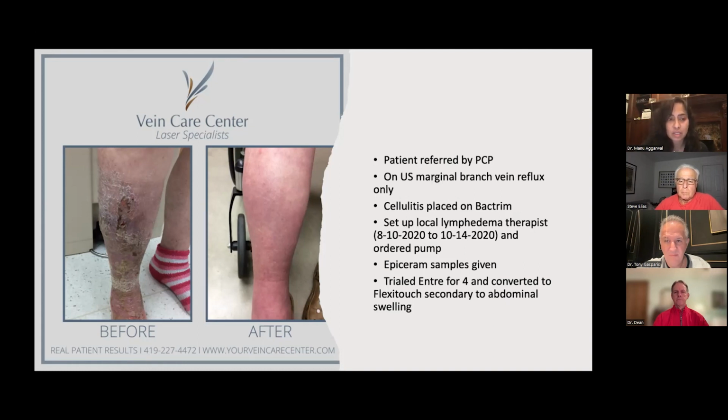There's a lot of things that go on to get this patient prepared to basically be discharged from therapy so that they can use their pump at home. And so oftentimes these patients, they really love their pump because we tell them, if you have your pump, one of the nice things is, especially in June, July, when it's super hot and they really don't want to wear their compression garment, they may use their pump even twice in that day because they really want to be lazy with their compression garment.